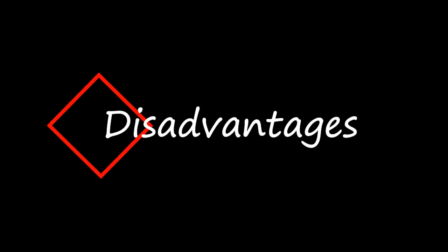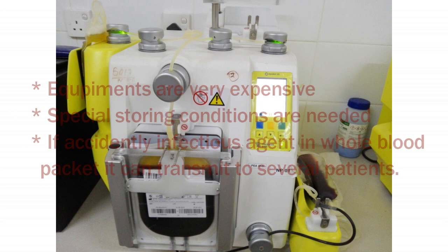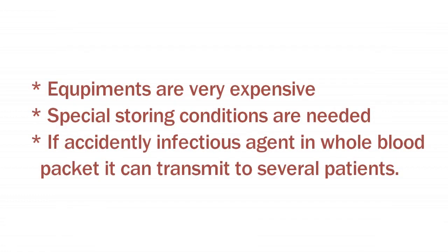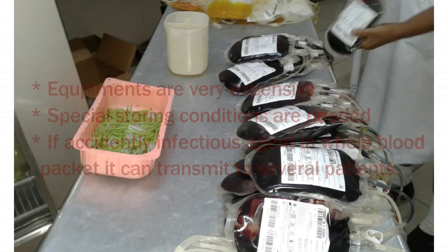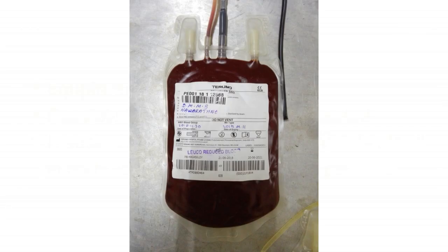The disadvantages: as the equipment is very expensive, when preparing components the initial expenses are very high. For example, we use several pieces of equipment like a plasma extractor, cold centrifuge, laboratory refrigerator, and so on. The second issue is that for each component, special storing conditions must be supplied. Third, if accidentally any infectious agent is present in a whole blood packet, it can be transmitted to several patients.